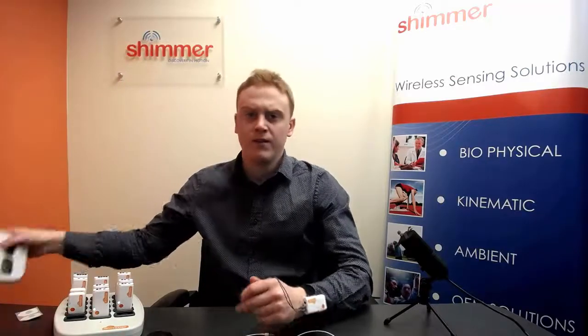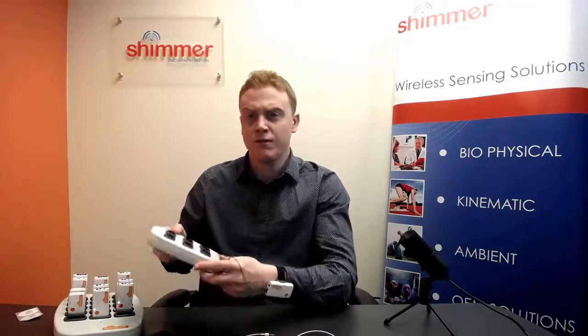The next item of hardware you require is a base or a dock. For today's example, you can see our consensus base 15 which enables the multi-sensor management of 15 Shimmer units at once. We also have a base 6 and a single dock that provides similar functionality when working with smaller quantities of sensors. The base connects directly to your PC or laptop via a USB port.